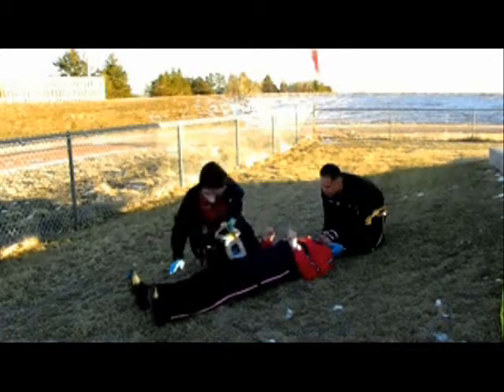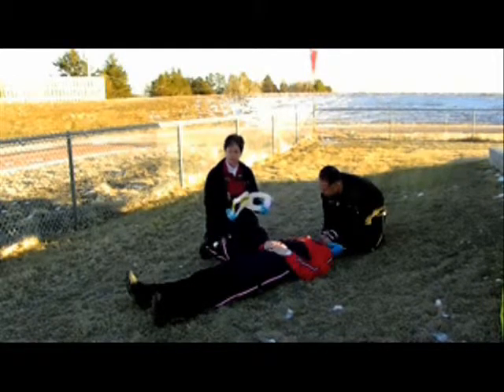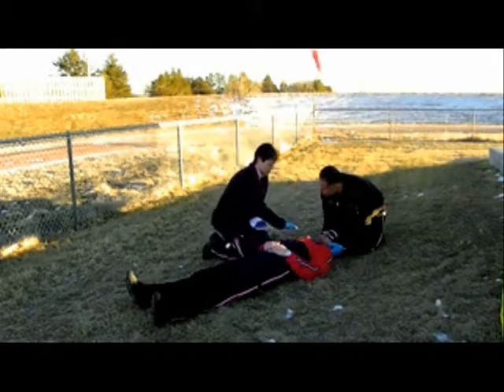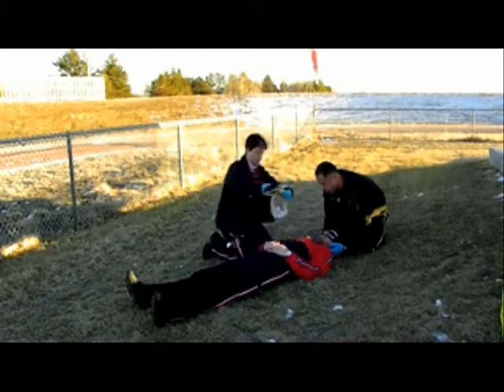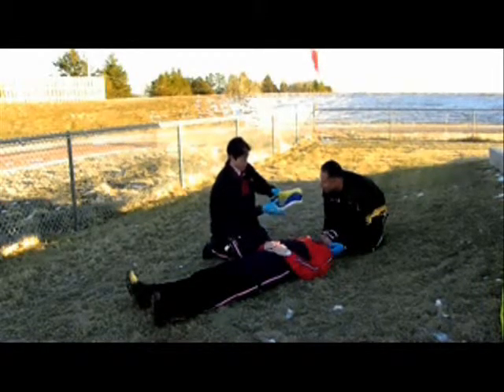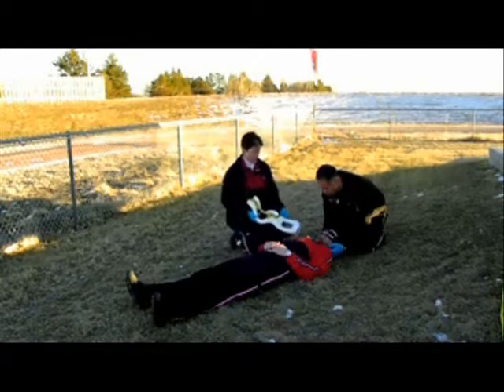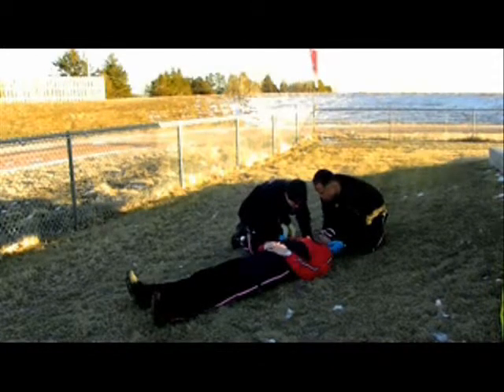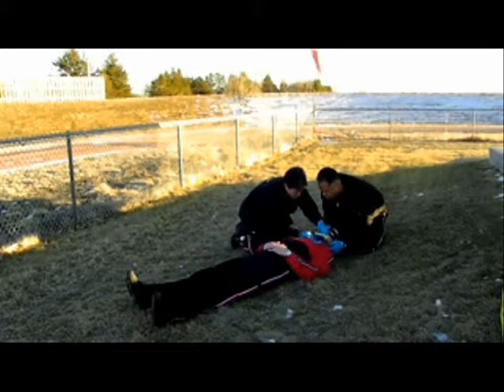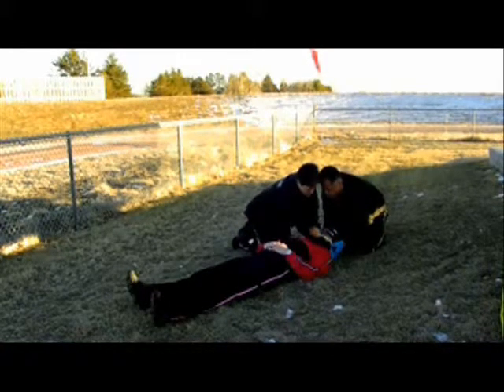Jason, can you feel me? Everything's working. Now we have your standard C-collar. A lot of different units and places have ones that are appropriately sized for different age groups — this one's adjustable. So what I'm going to do is measure from his jaw down to his shoulder, place it on here so that we know what distance to snap this into. We're going to place this behind his head. Hopefully it'll slide right through with some assistance in holding that C-spine in. We're going to wrap it around here — we want this to fit snugly, but not too snugly. We want his head immobilized.